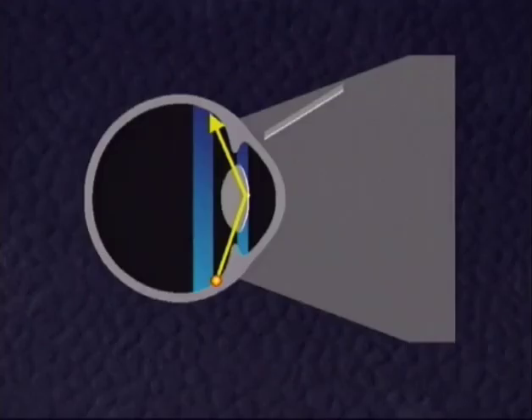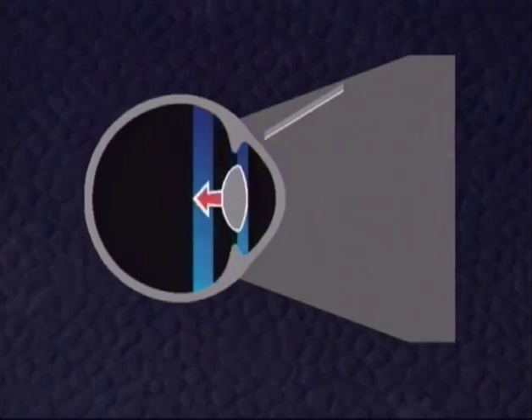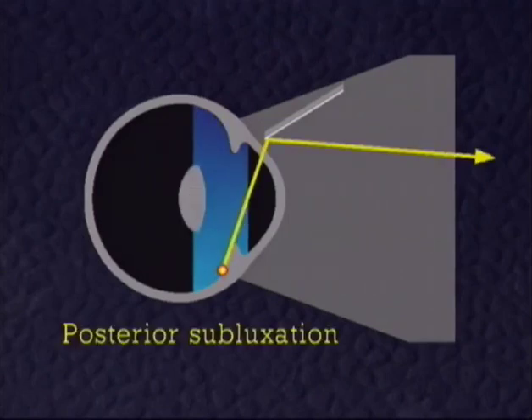Without scleral depression, the outermost periphery can only be seen if the lens position has changed. On the one hand, the periphery becomes visible if the lens is completely absent, and thus cannot interfere with the rays from the periphery, that is, in aphakia. Also, the lens does not interfere when it has been posteriorly displaced, that is, in posterior subluxation of the lens.